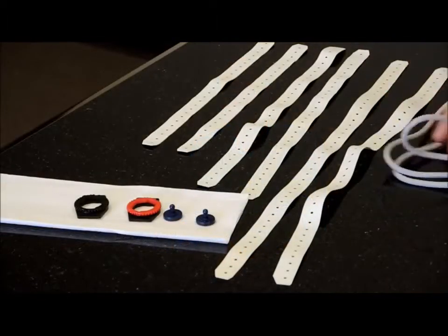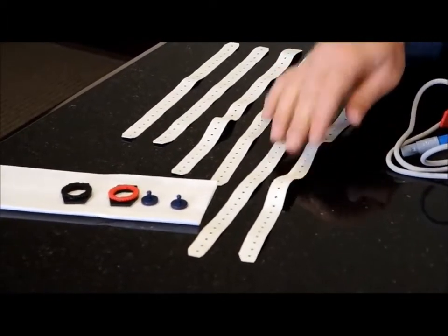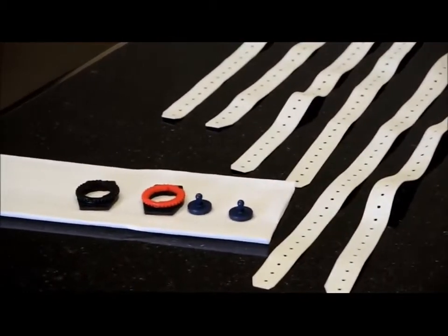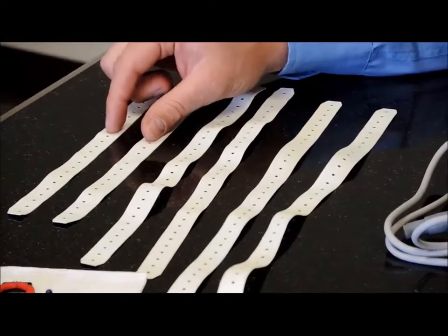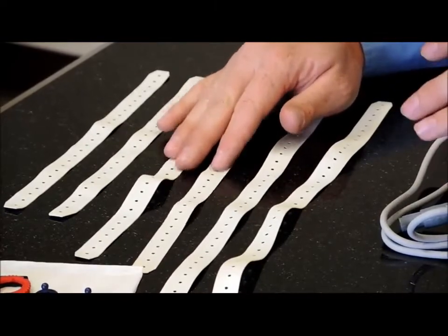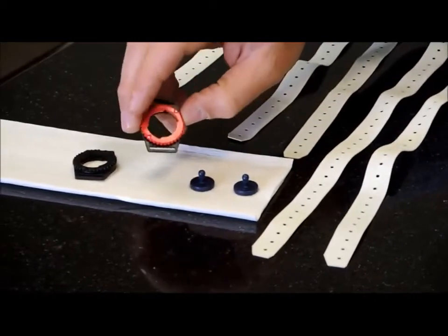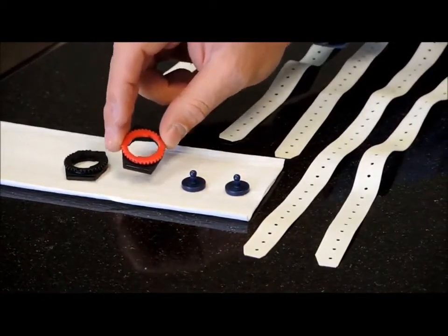Other items that come with the Nanoduct are a total of 6 straps, 3 sets of different sizes. There's a large size, a medium size, and small size. With each patient or each subject, the size may vary depending on the size of arm that the patient has. If you're testing mostly neonates and babies, obviously you'll use the small size. Some younger age children or teenagers may use the medium, or smaller adults and larger adults may use the larger size. To use the straps, we have these retaining posts and holders, and these are the holders that the sensor cell and the pilogel will go in, and you'll see how we use these when we demonstrate on a patient.